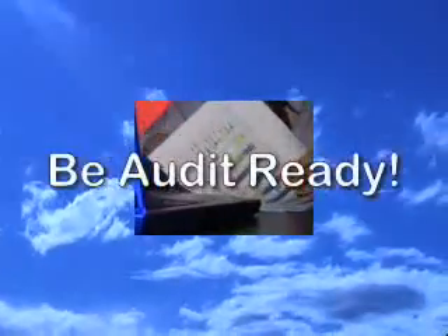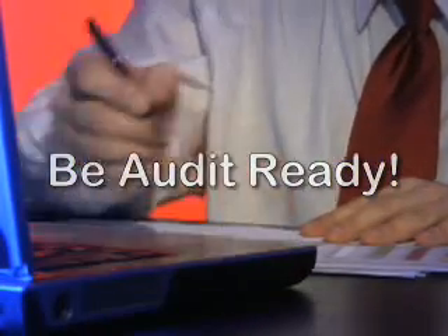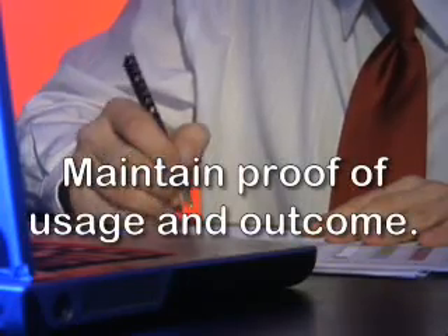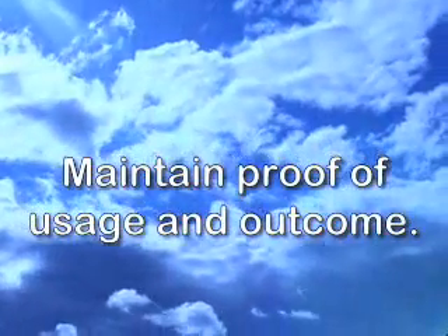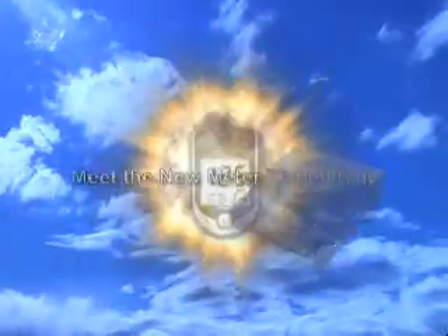The Eosene system can make you audit ready. Maintain proof of usage and outcome for all your patients. Our meters are comparable to others on the market and the Eosene system surpasses their technology.